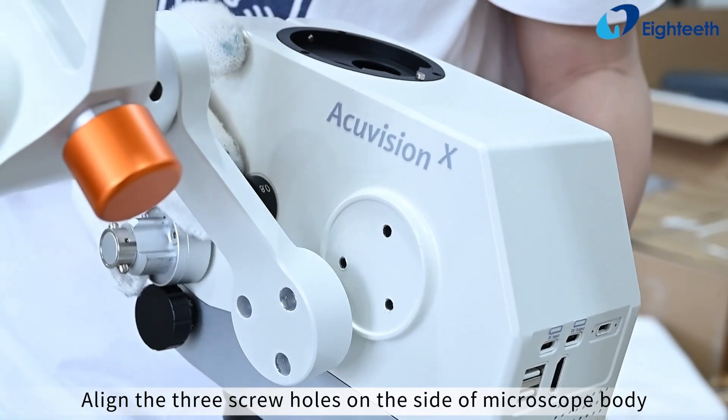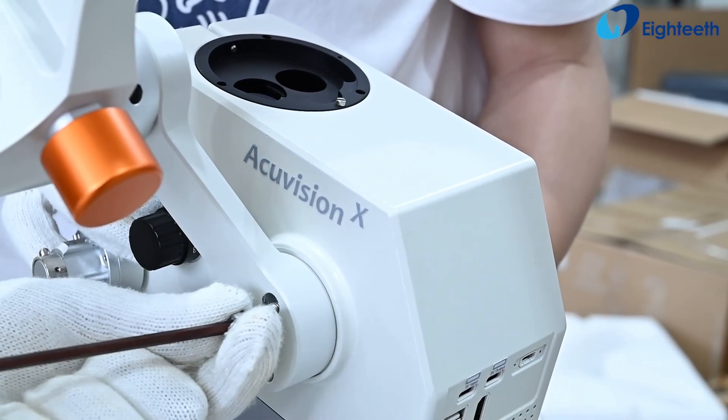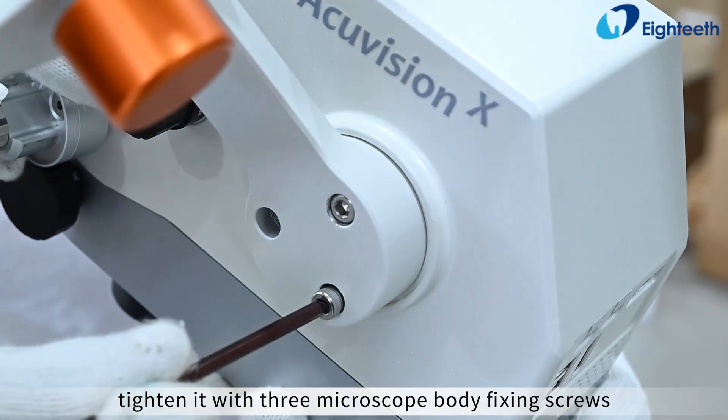Align the three screw holes on the side of the microscope body with the three through holes on the connecting arm, and tighten it with three microscope body fixing screws.